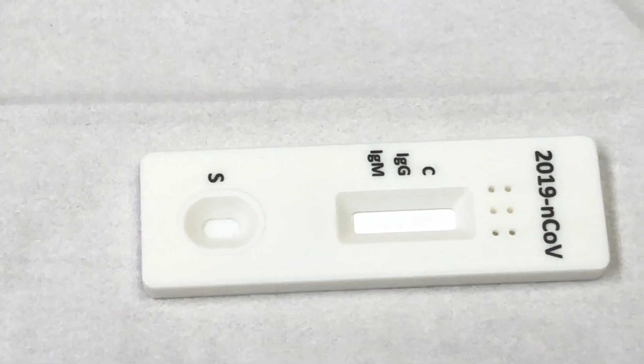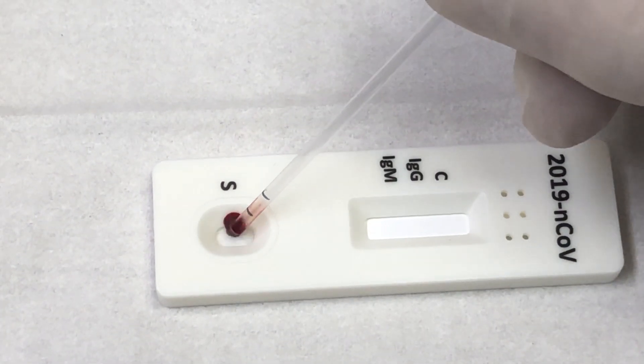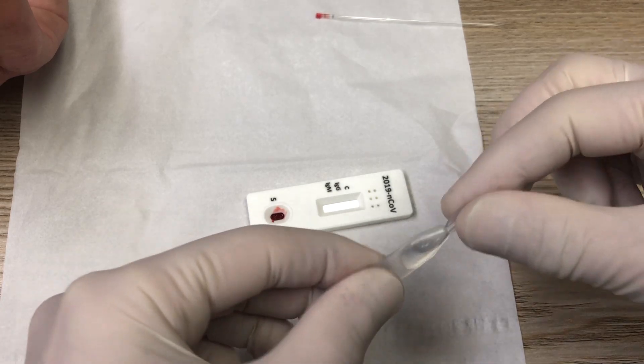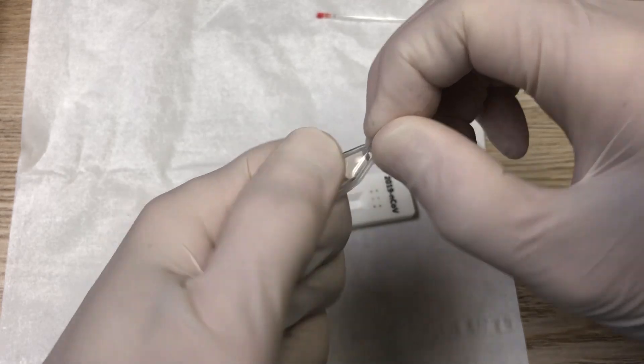You deposit the blood in the well on the membrane. Then you open the reagent solution and put two drops of it in the same well.